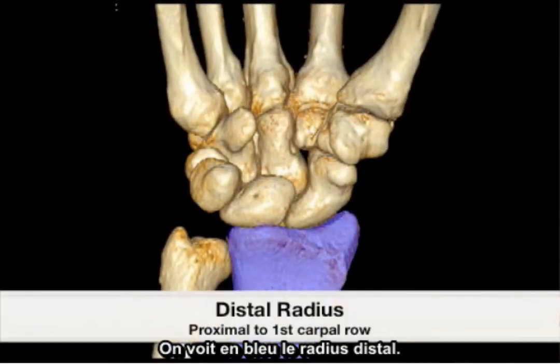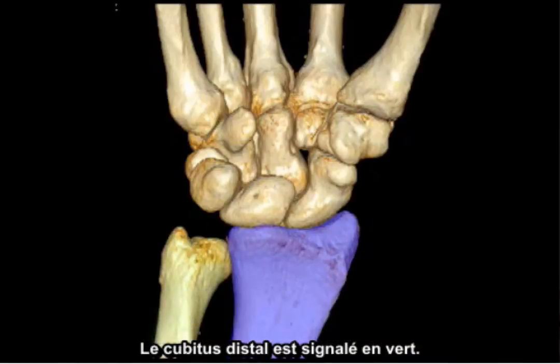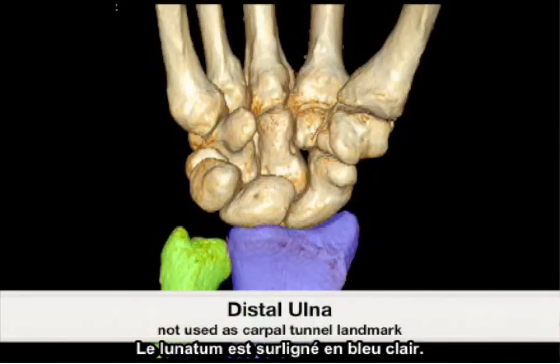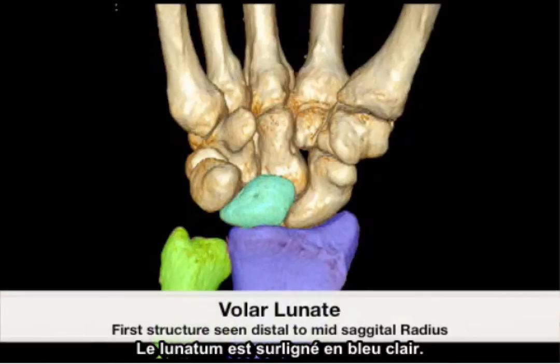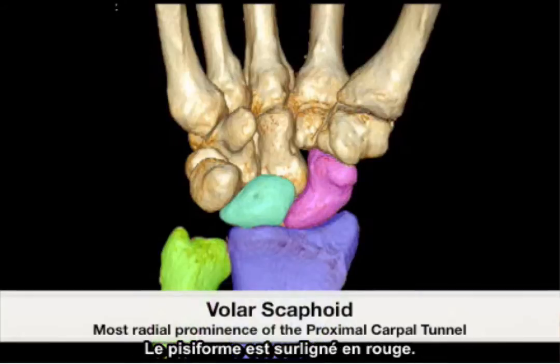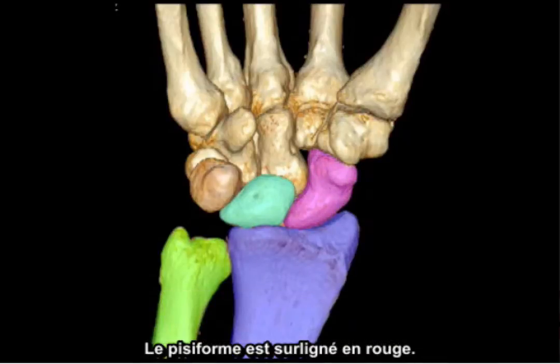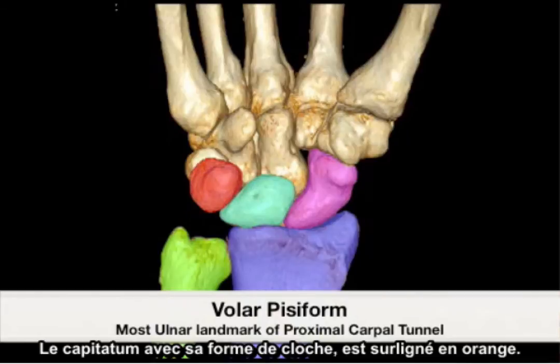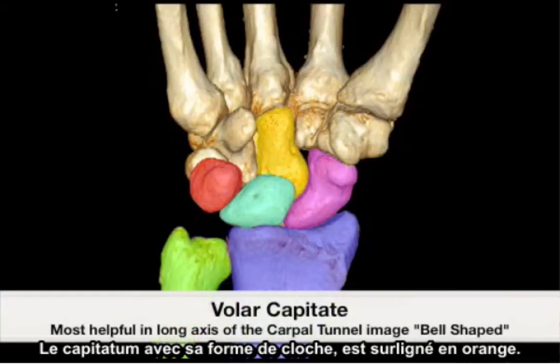Highlighted in blue is the distal radius. Highlighted in green would be the distal ulna. Highlighted in light blue would be the volar lunate. Highlighted in purple would be the volar scaphoid. Highlighted in red is the volar pisiform.